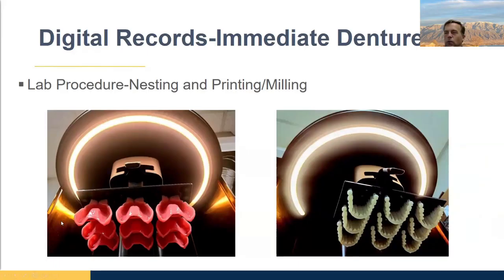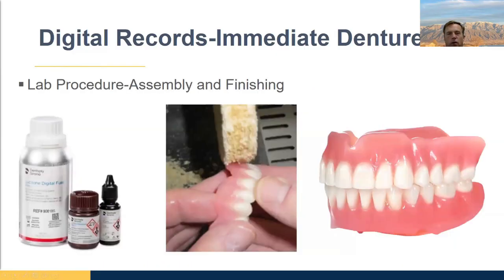print these, what do we got, 9? If I printed 1 or 9, it takes the same amount of time, because the time for printing is layers. And the other thing is that instead of taking a big chunk of acrylic and grinding it down to make my denture, I'm applying only the resin that I need, so it's less wasteful. And the equipment for printing is easier to keep clean. It doesn't get beat up in the same way that a mill does. So there's my answer for that.